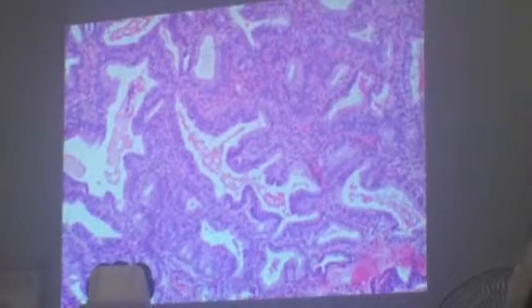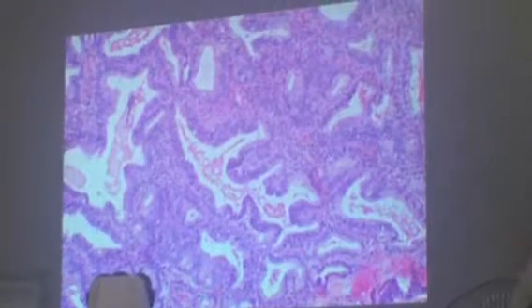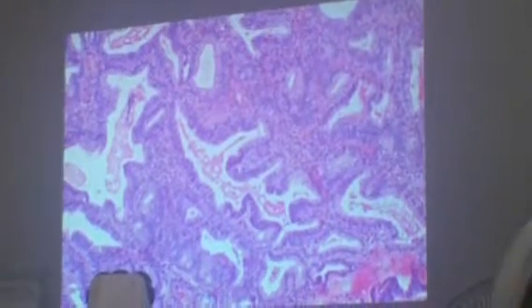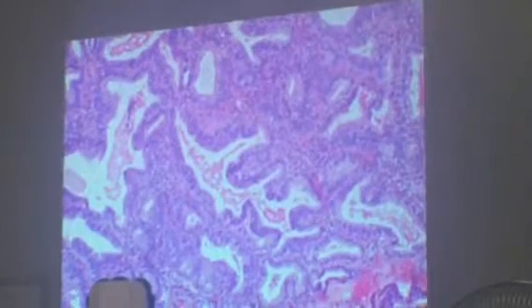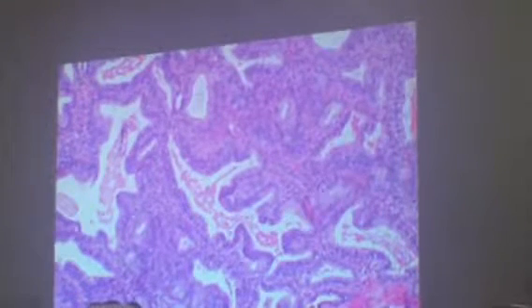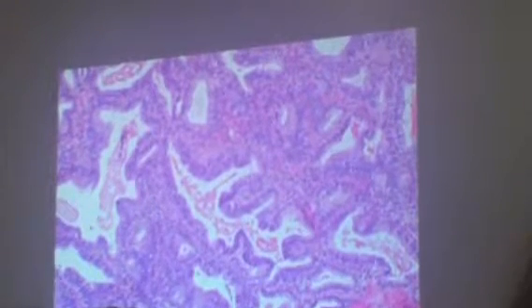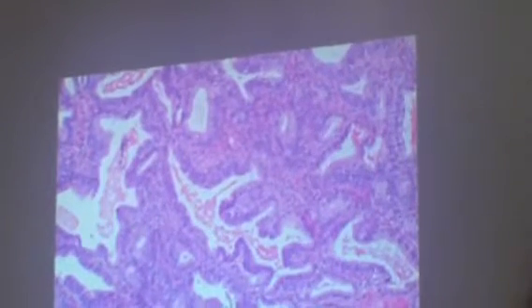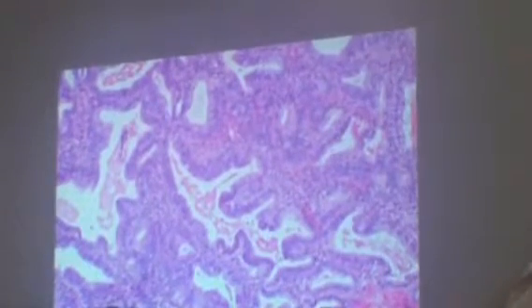Again, in some cases, you have to look carefully and rule out a polyp. But more often than not, complex hyperplasia is really complex hyperplasia. Okay, simple hyperplasia may not always be simple hyperplasia if you see the fibrovascular core, kasi pwedeng nakadisguise siya sa polyp. Okay. Or rather, a polyp may be disguised as simple hyperplasia. But normally, polyps do not have the irregularity of a complex hyperplasia. Okay?